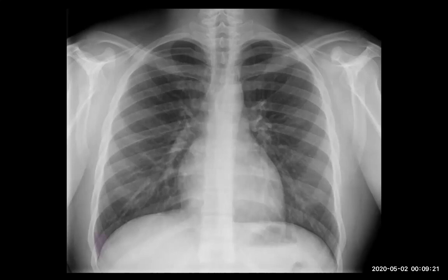For A, this is the bronchi — the main bronchi, then right and left. For B — the bones — we have mainly the ribs, clavicle, scapula, and head of the humerus. For a normal chest X-ray in inspiration, which in most cases we use, we have to see at least about six anterior ribs visible on the frontal radiograph.